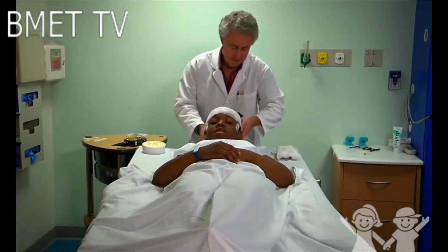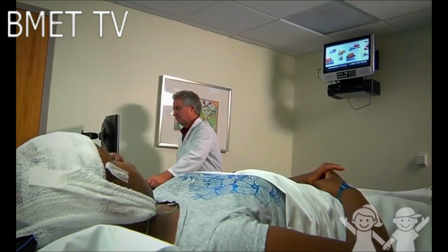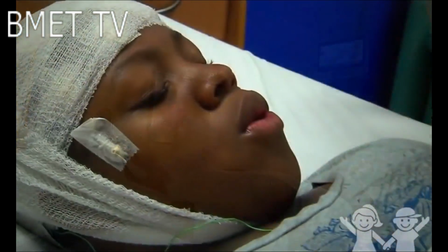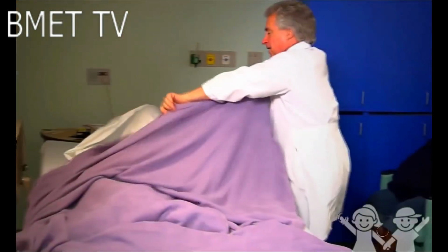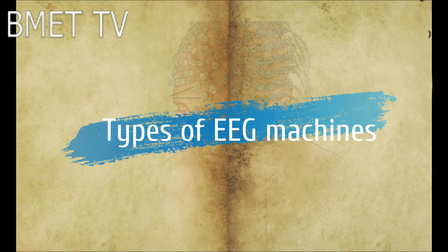EEG neurofeedback machines, also called EEG biofeedback machines, are EEG systems that allow a subject to see their brain activity in real time. During this type of EEG monitoring, the EEG machine is synced up to a computer or a cloud device, and the subject's brainwaves are displayed on a computer screen. Let's look into types of EEG machines.